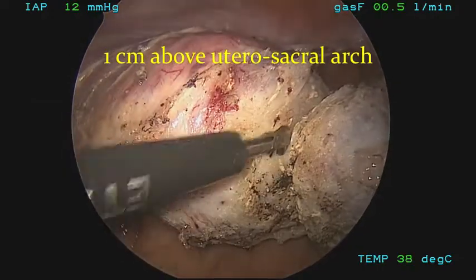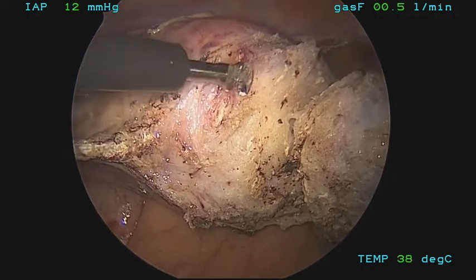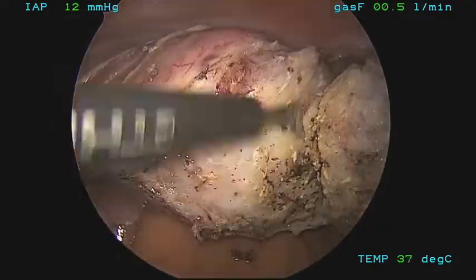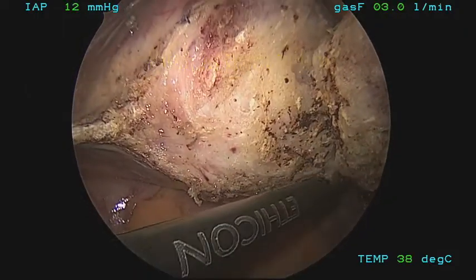Bleeding is well controlled, and there is no spillage of any tissue. Traction is applied after hemostasis is obtained. You can see that the uterine artery on the left is well secured and sealed. There is a uterine manipulator present, and care must be taken not to transect this manipulator.